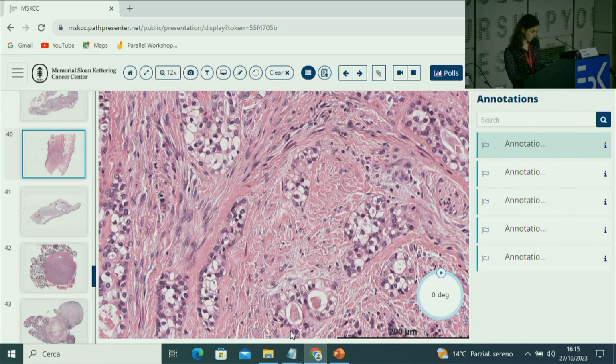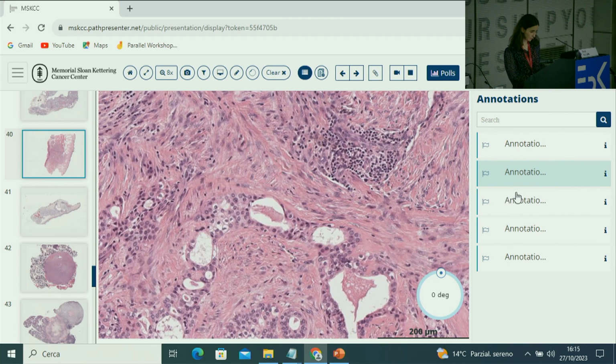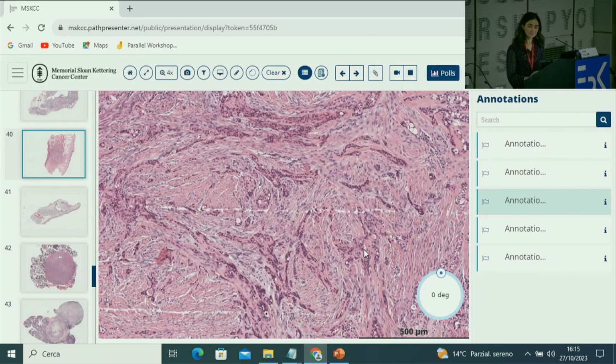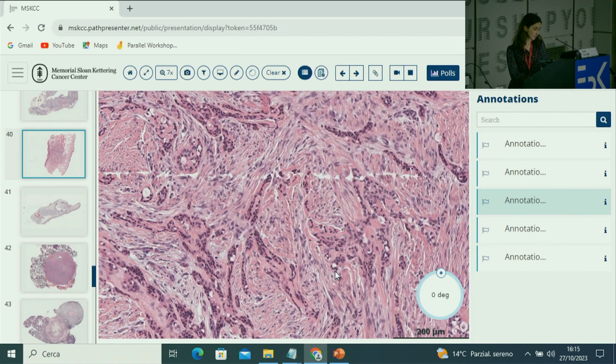There are some ductal formation. Here we see also a few ducts. And here we see the stroma of this tumor. Any idea? Is it mucoep, you think? Well, the mucoep should be considered because you can have variants of low clear cells. It is very sclerotic, but very definitely, yeah. So, in addition to mucoep, what other options do you think here?